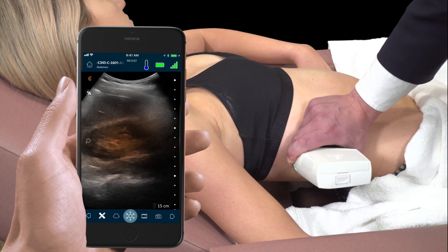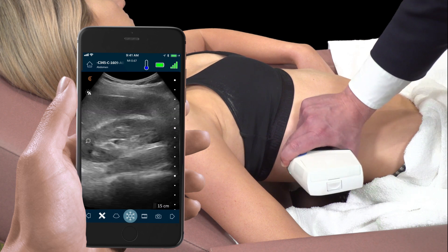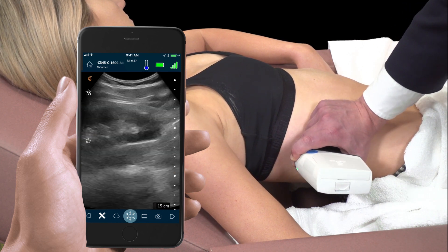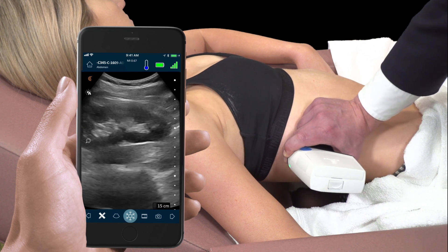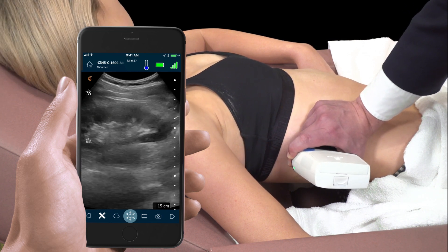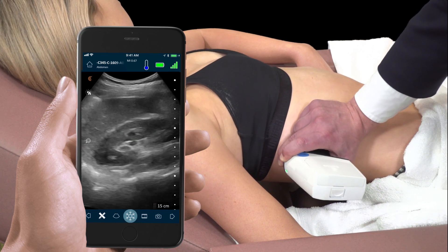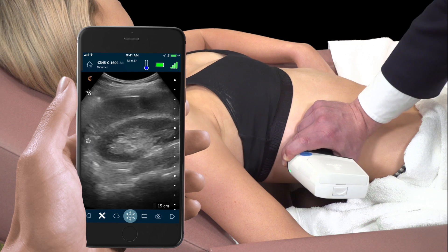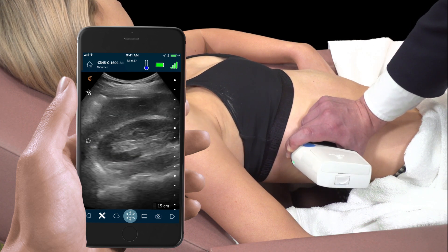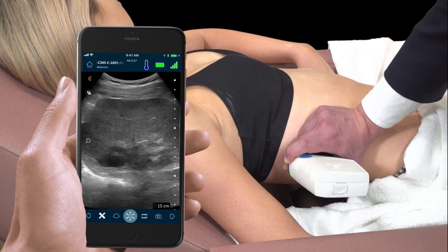To approximate the size, make small rotational motions of the scanner to find its longest aspect. Visually compare the renal parenchyma with the hepatic parenchyma. Normal renal parenchyma should be the same brightness, or isoechoic, to the hepatic parenchyma or darker.